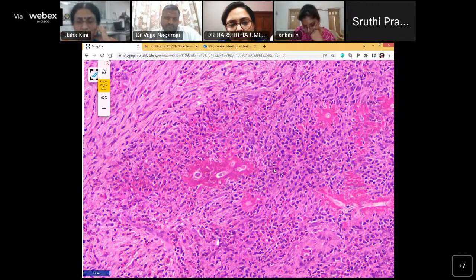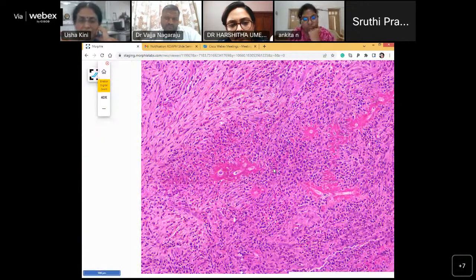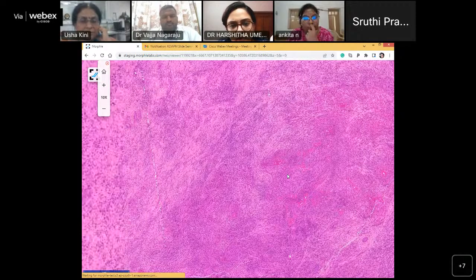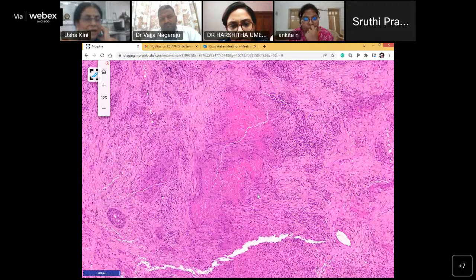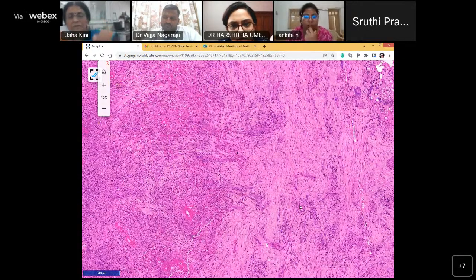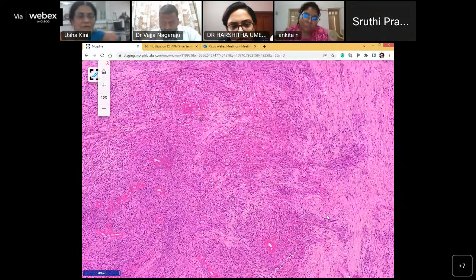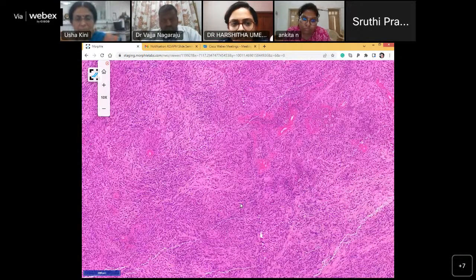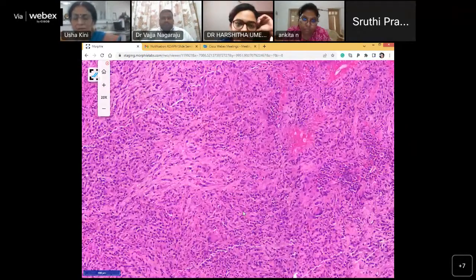And there's so much so that what you described as geographical necrosis here is because of that, and the tissue has cracked here. Okay, and you have multinucleate giant cells somewhere to tell you that it has induced a reaction. But the clue to the extraneous object here being the fungus are the eosinophils. The tissue is loaded with eosinophils. See, sheets of eosinophils. So you need to answer why those eosinophils.